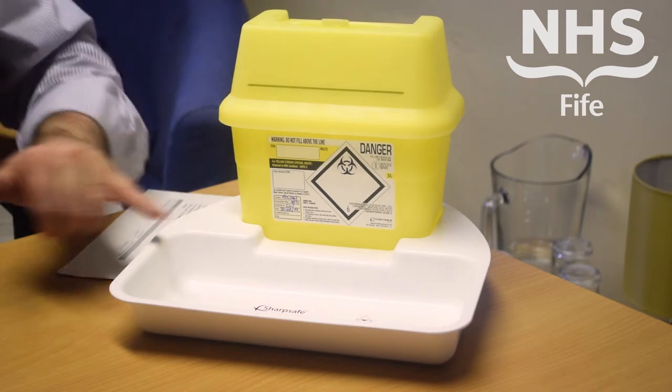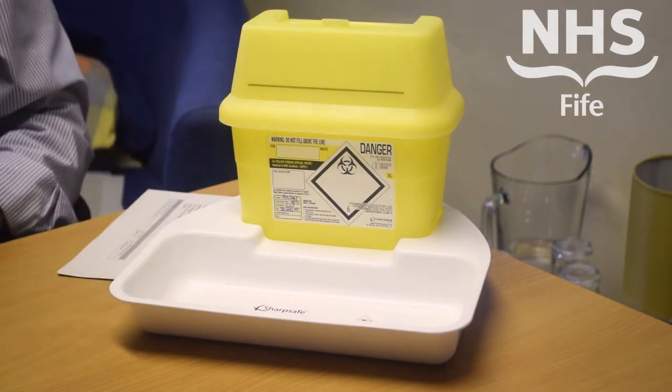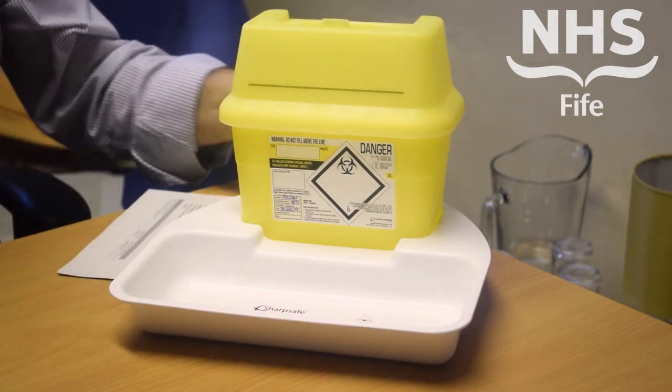Once the bin has been locked and fully closed, make sure that you fill in the closure details, and also put on the tag to indicate where the bin has come from, and then dispose of it according to local practices.